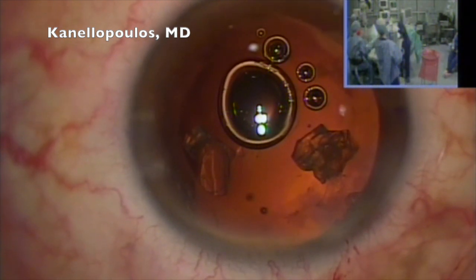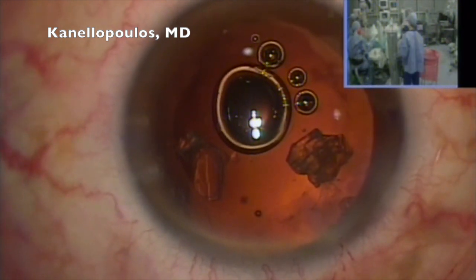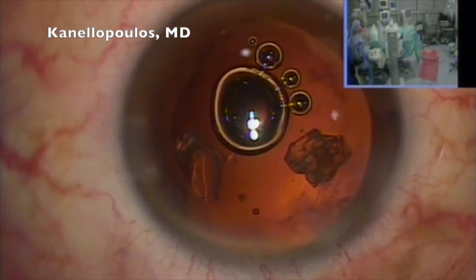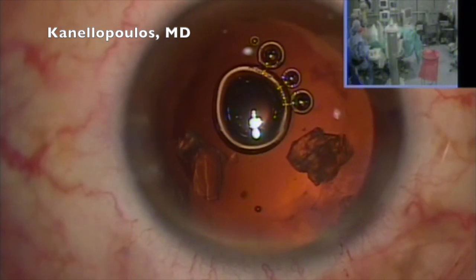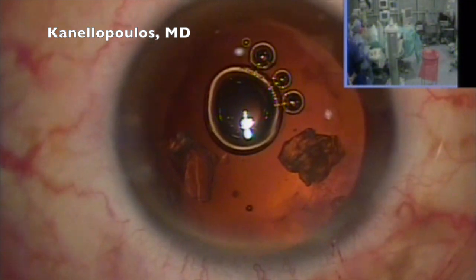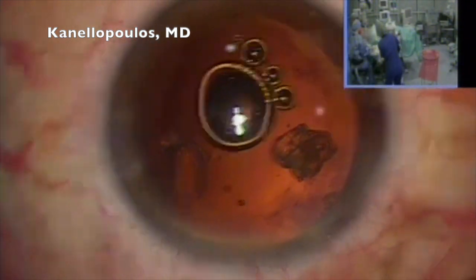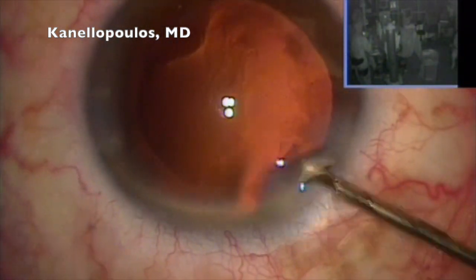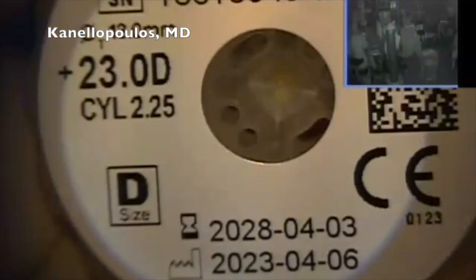But it's always good to run. These videos are real-time, they're unedited. So you can see on the top right the team working frantically to change — we're in a new cassette, we're priming the FACO tip. I have achieved to remove the cortex with the viscocannula, methocellulose here.